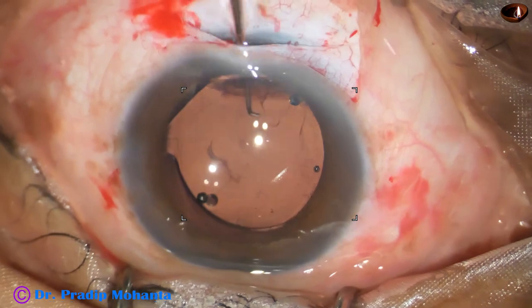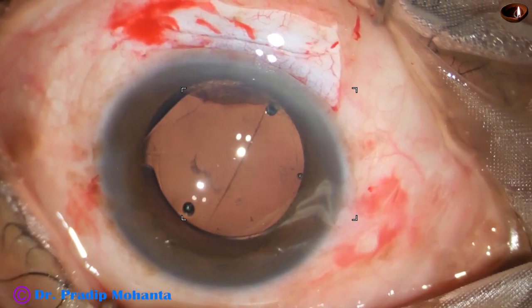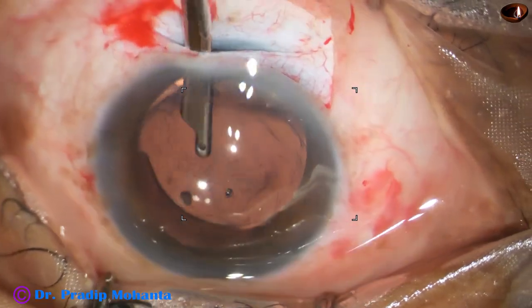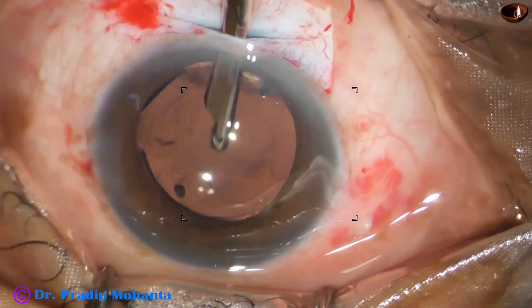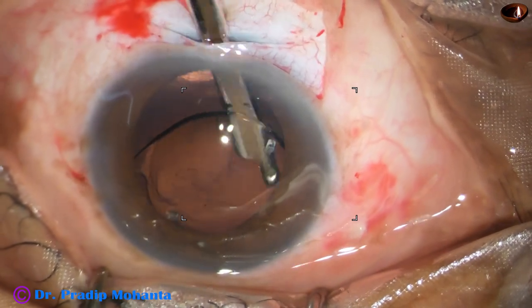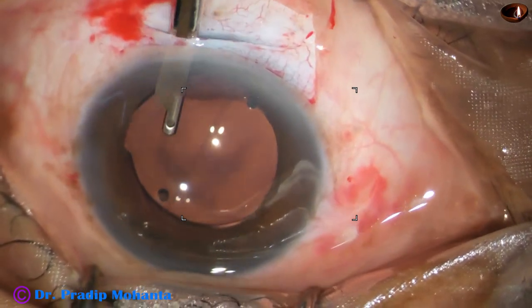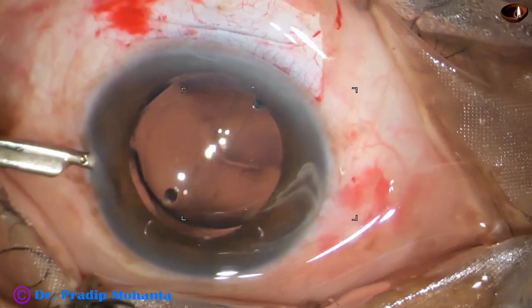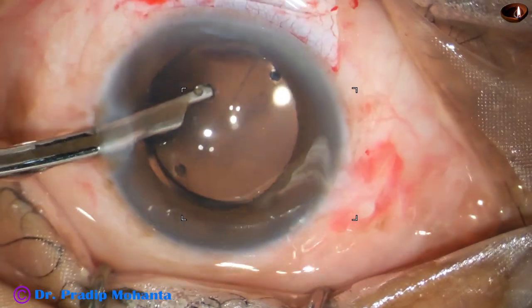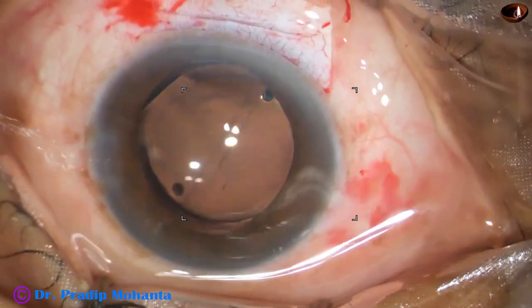Now it is time to remove the visco using a 23-gauge Simcoe cannula. First, irrigate the anterior chamber, then go behind the lens and irrigate the capsular bag, then irrigate the anterior chamber again and come out. Irrigation and aspiration is also done through the side port. Very thorough cleaning of visco helps a lot — the patient has normal intraocular pressure the next day and remains very happy.